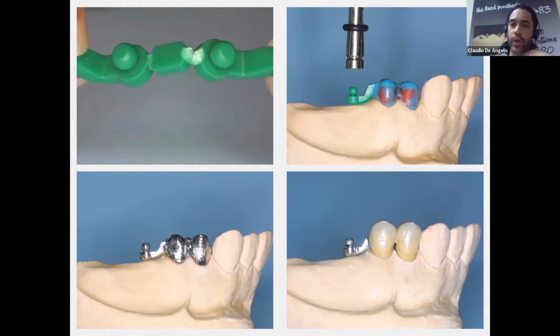This said, after connecting to the crowns, we cast, the dental technician puts the sprue, they cast their crown and the attachment. I suggest to always prepare at least, remember, 2 crowns. Never prepare, doctors, please never prepare only 1 crown. Always connect 2 crowns together, okay? 3 is better, 4 is even better, but the minimum is 2.